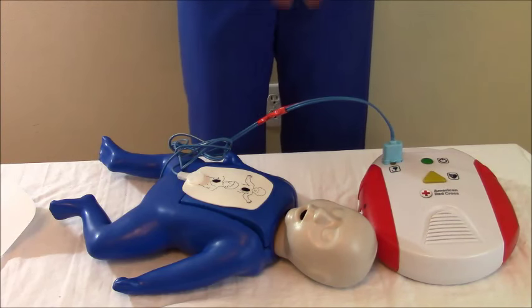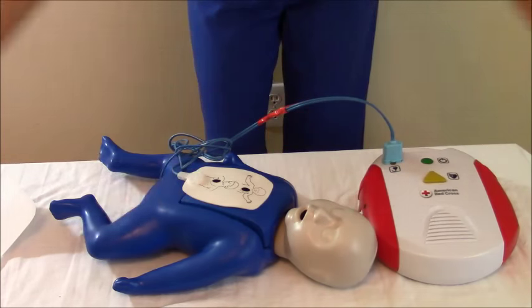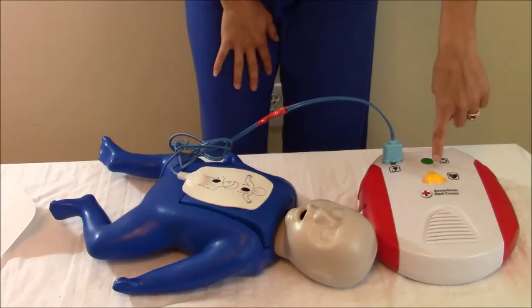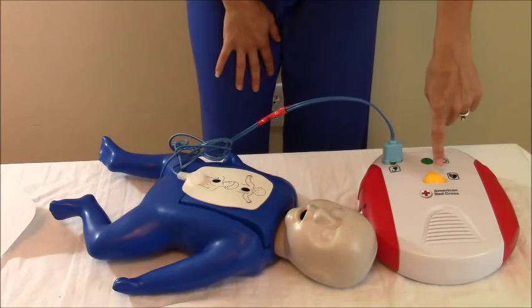Make sure everyone is clear — stand clear. And whenever everyone's clear, you're going to hit the shock button, which is blinking. And clear — shock delivered.